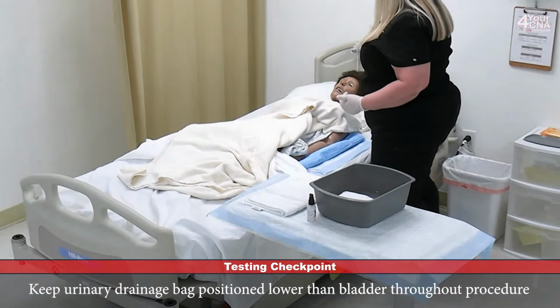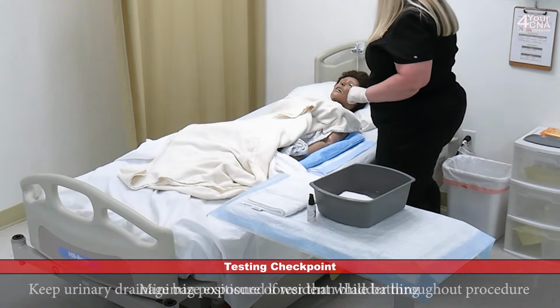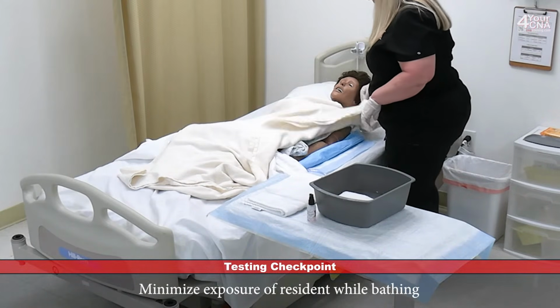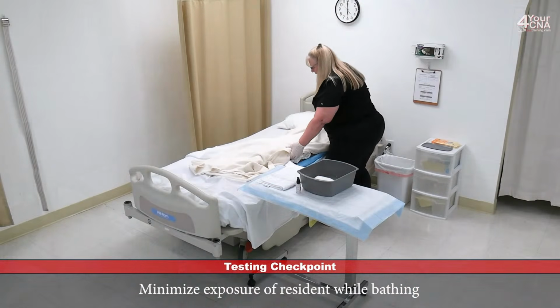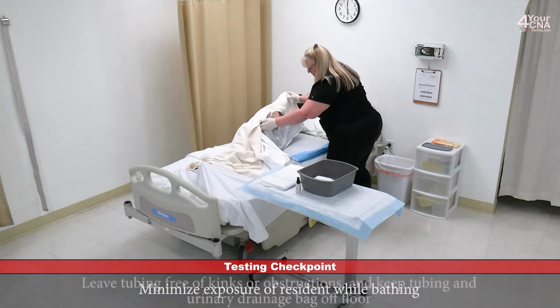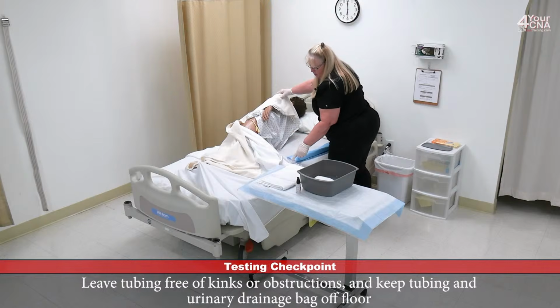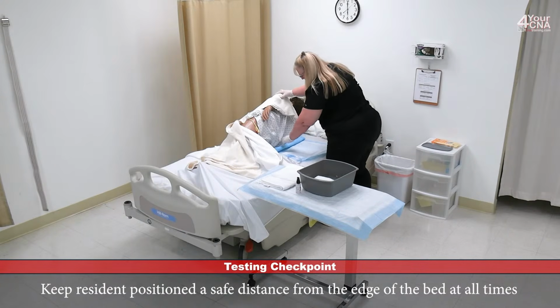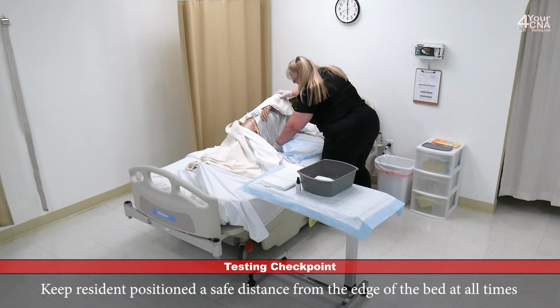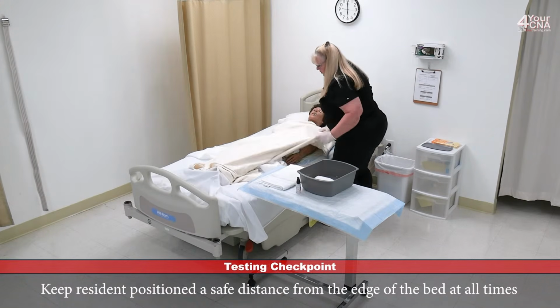In just a moment, I'm going to ask you to scoot toward me. I'm going to roll you on your side, and then we'll spread that underpad out. So on the count of 3, go ahead and scoot toward me. 1, 2, 3. Thank you. And now I'm going to roll you on your side. 1, 2, 3. And as I roll the patient, I want to be careful not to put any stress on this catheter or the tubing. You don't want it pulling tight. So I'm going to unroll the chux underneath the patient and tuck it under her hip. Miss Jones, come on back and scoot to the middle of the bed, please.